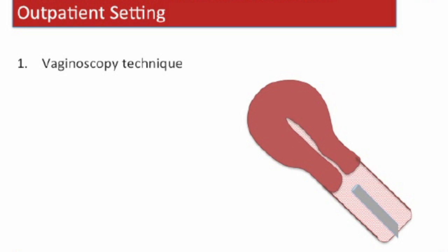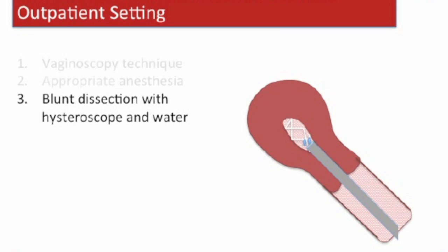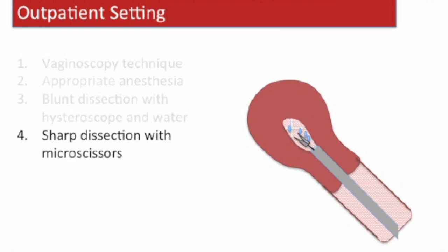We employ the following approach when performing outpatient hysteroscopic lysis of adhesions. Vaginoscopy is used to attain access to the uterine cavity. Patients are offered several anesthetic options, including non-steroidal anti-inflammatories or IV sedation. Depending on the location of the adhesions, it may be reasonable to start with blunt dissection using gentle pushing with the hysteroscope and pressure of the flowing saline to break apart the adhesions. Sharp dissection with scissors is used to break apart dense adhesions.